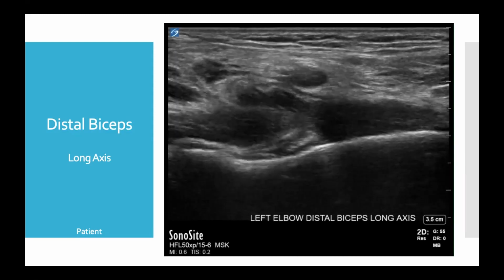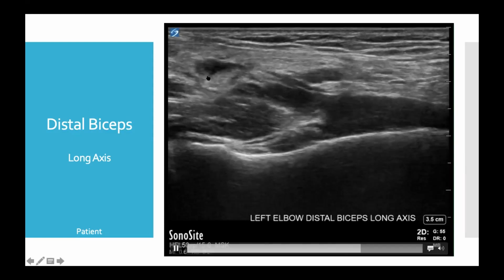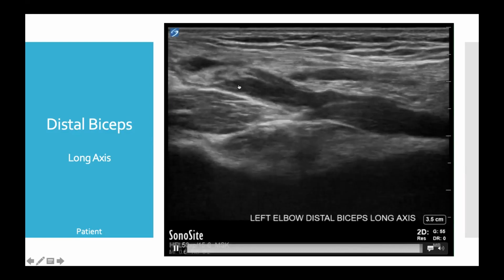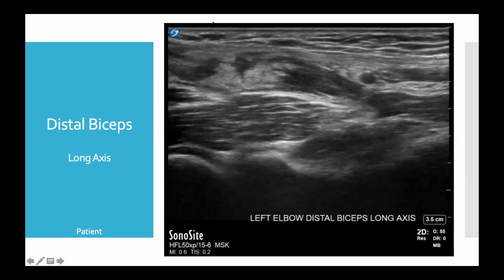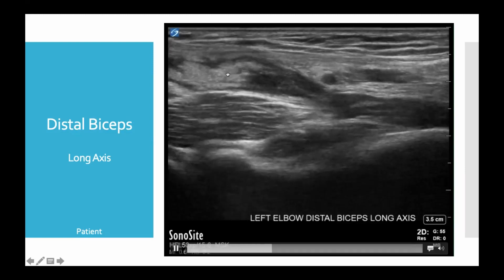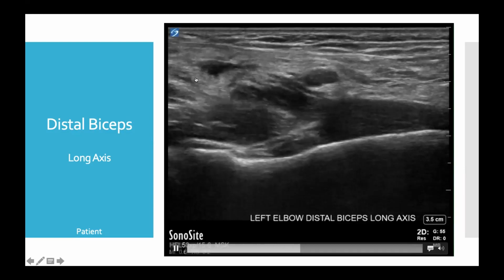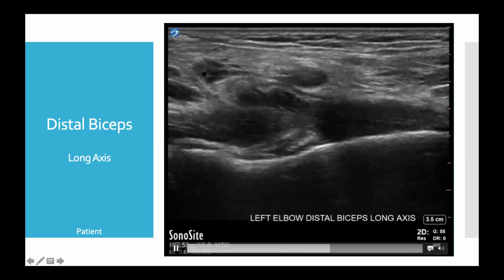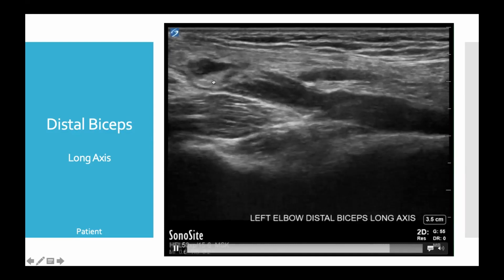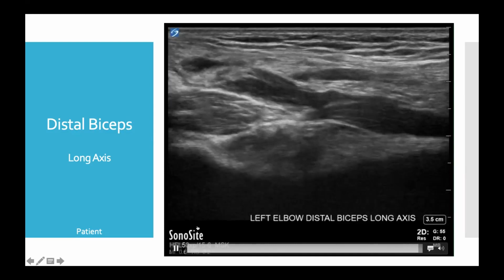And we can see more laterally towards our dot over here, or I guess more proximally towards our dot, we have a hyperechoic bundle, and it looks as though that is where the distal biceps tendon has settled after this essentially complete rupture, and that's where we have our proximal stump.